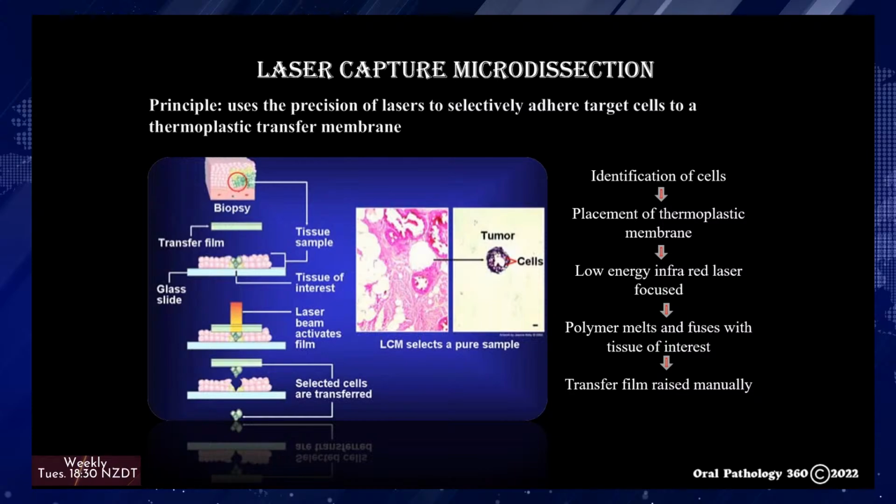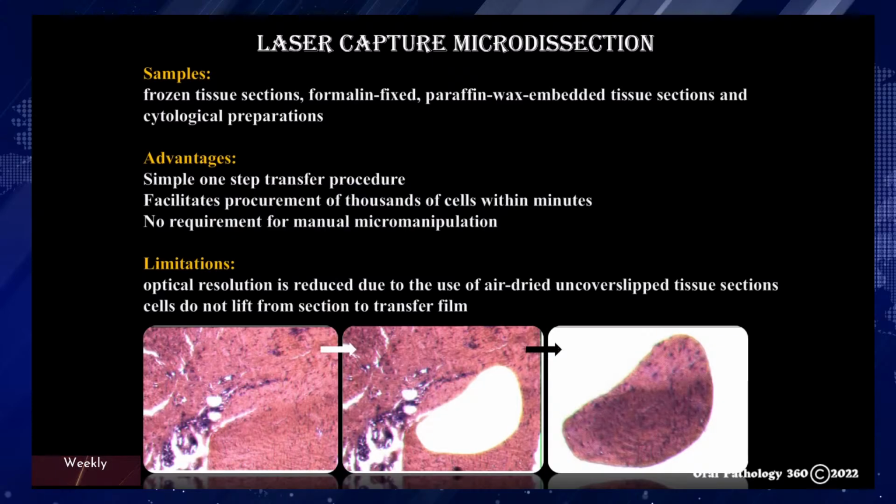Laser capture microdissection. The laser capture technique was developed in the 1990s by Dr. Buck and colleagues at the National Institute of Health. Laser capture microdissection is an automated sample preparation technique that enables isolation of specific cells from a mixed population under microscopic visualization. Laser capture microdissection is a powerful technique that enables oncology researchers to compare molecular profiles of tumor tissue to surrounding non-tumor cells.